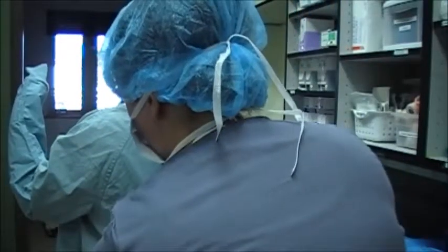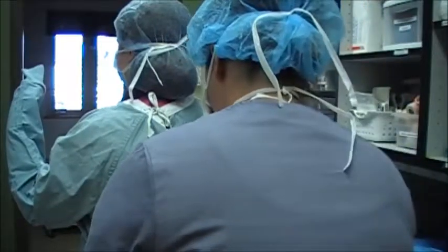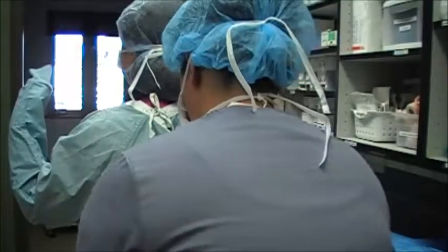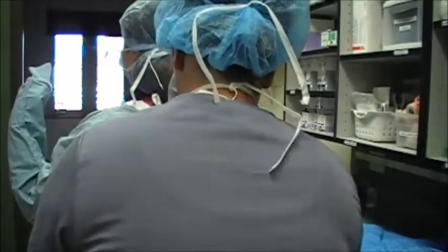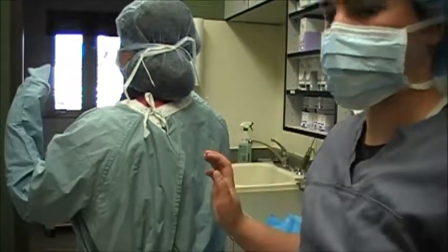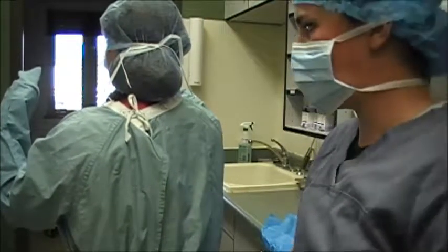Alright, I do the same — I grab just the strap of the gown and pull it around to meet. I'm maintaining that my doctor has enough room on all sides so she's not contaminating her sterile gown in any areas. And then we are ready to go in for surgery.